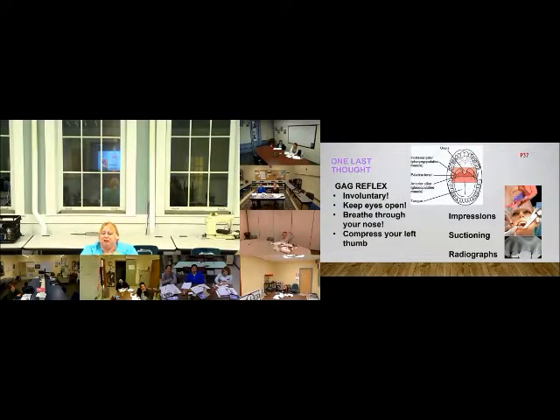So tell the patient, keep your eyes open, breathe through your nose, compress your left thumb, something about a pressure point there, and find a point on the far wall and keep those eyes on it, focus on it. This is the one time when you're an assistant that you've got to be a cheerleader. So I have made every silly face in the book to keep my patients' eyes open and cheered them on through an impression that I needed to leave in their mouth or a radiograph I needed them to hold in so that I could press the button long enough. So this is the one time when you really do your cheering here.